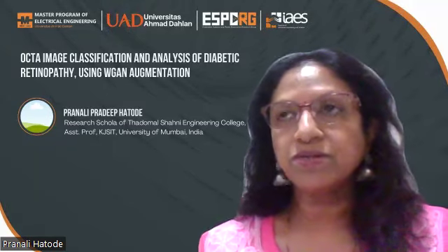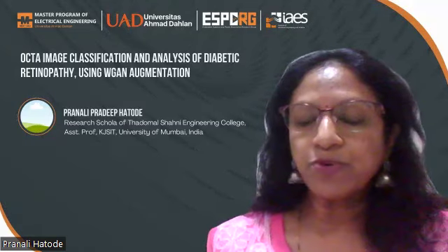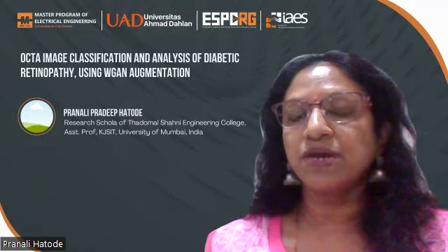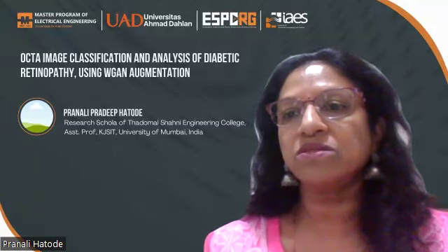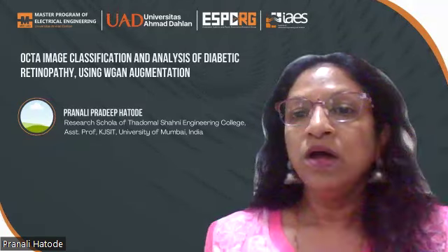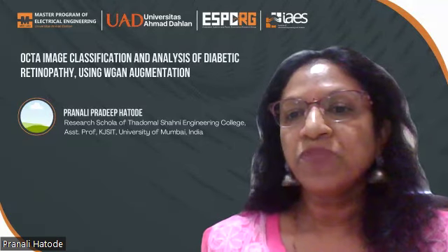For that, various augmentation techniques were tried. After that, I came to the conclusion that WGAN was the best augmentation technique over the conventional augmentation technique of enhancing the data by rotating, flipping, clipping, etc. What WGAN actually does, we will discuss later.